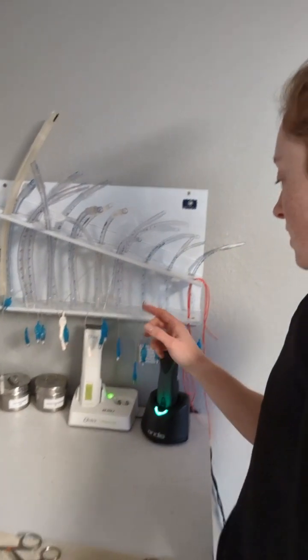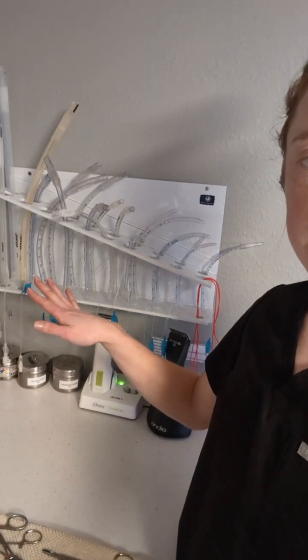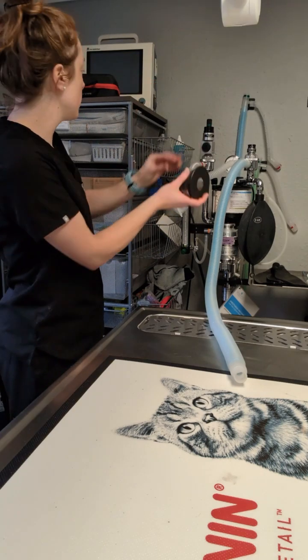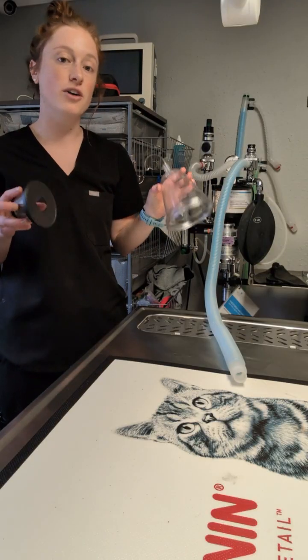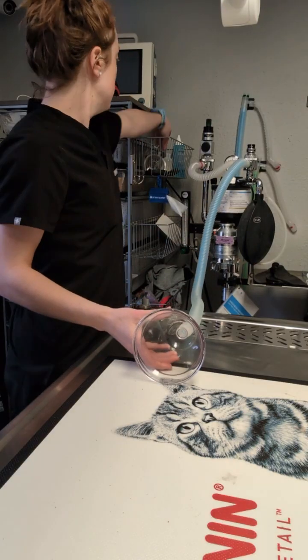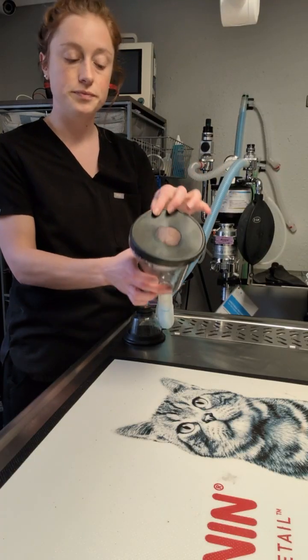The first part of our anesthetic setup is the endotracheal tubes. We have a combination of silicone and PVC Murphy endotracheal tubes, and we use a rubber tie to secure them. We select the correct size based on the size of the patient. We also have a couple of different sizes of anesthetic masks that we can attach to the breathing tube to deliver oxygen directly to the patient if they're not intubated. It attaches on the end here and goes directly over the snout. We have covers if we want to make sure that there isn't any gas escaping into the room.